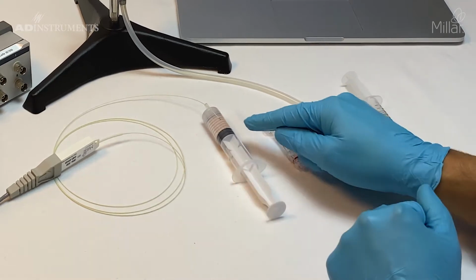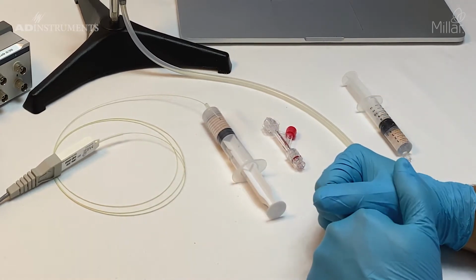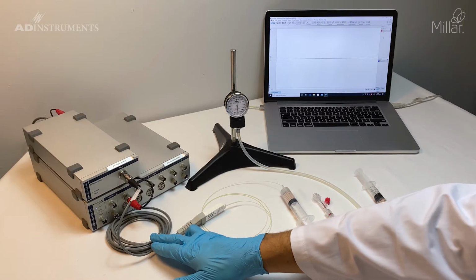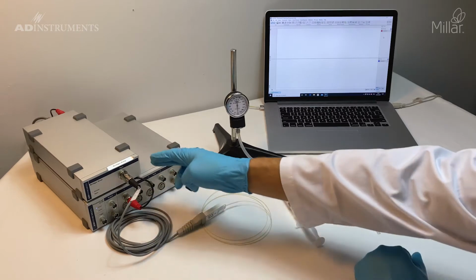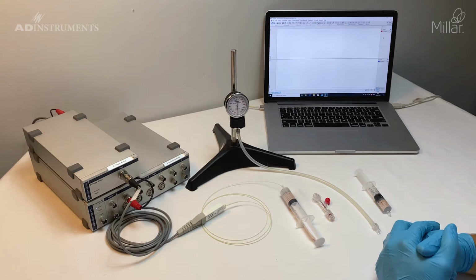The catheter is soaking in 37 degree saline for at least 30 minutes before use and before calibration. The catheter is connected via an AEC 10D interface cable to a bridge amp, which is connected to a PowerLab running LabChart software.